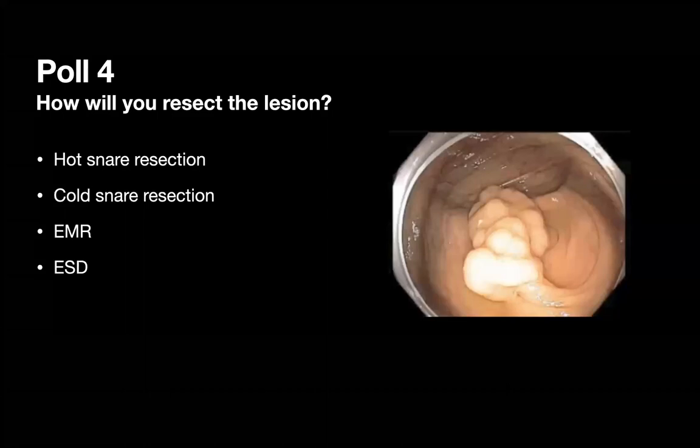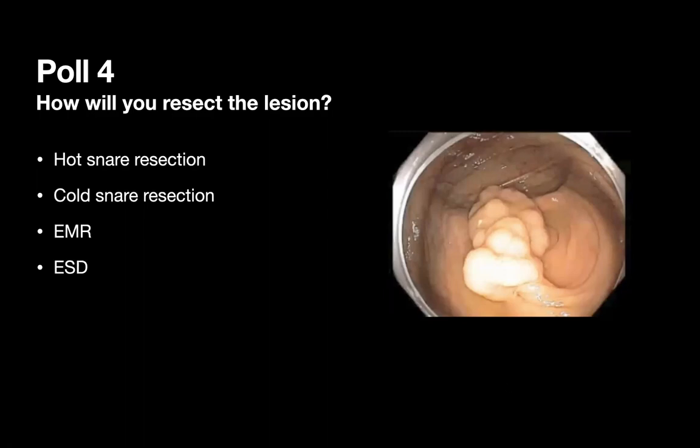So if I have removed a lot of polyps, and this is next to an appendix in the cecum with a larger polyp, there are higher risks of polypectomy. If I don't feel comfortable, then I come back. But if this is the only polyp I'm dealing with, I would just go ahead and resect and explain, because I also presume, not just for me, for anybody who is attempting to do this, we would have had these conversations ahead at the time of consent about why we are doing this and what we are likely to find occasionally. So I would go ahead and resect.